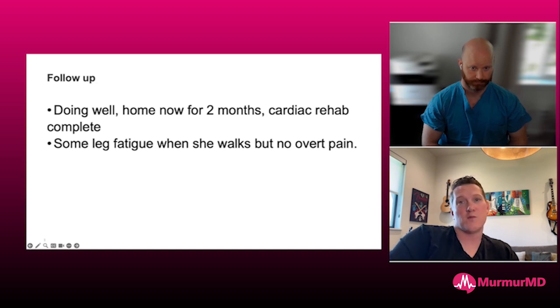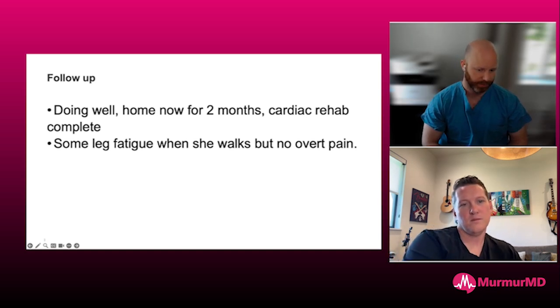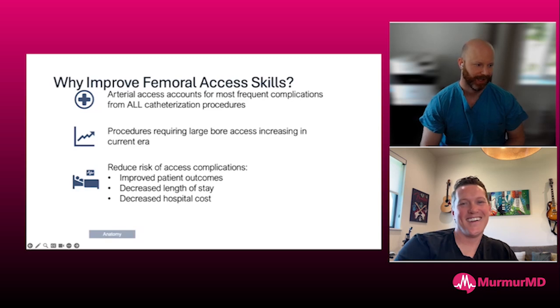And it's not just for large bore. You put an 8 French sheath in, you're still going to have much better hemostasis. And also important, you're not going to get called all night with the oozing groin. I completely agree. Regardless of the size of femoral arteriotomy that we perform, we give protamine. If we've given heparin and you have a femoral arteriotomy, you're getting protamine from us for sure. I love it.